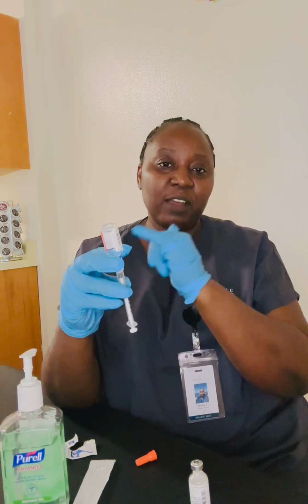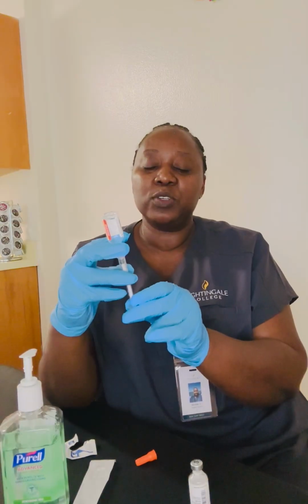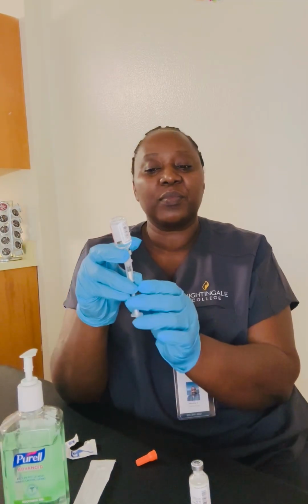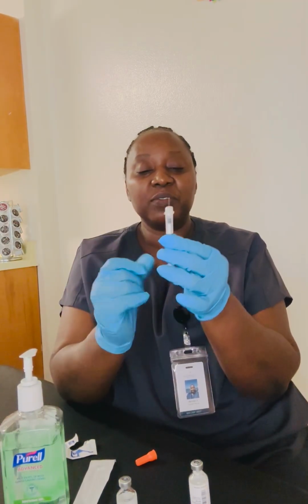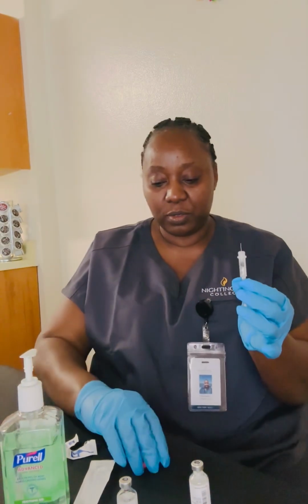At this point, I've mentioned that I've recorded the blood glucose check that I had of 110 with the nurse verifying it. Then I'm going to gently draw up 4 units of the regular. 4 units regular, gently lift the vial up, put it down. If there is any bubble at this point, I'm going to fill. If there is more bubble, I'm going to tap at the bottom for the bubble to go out. Verify this with the second nurse with me. I have 4 units of regular insulin drawn up.